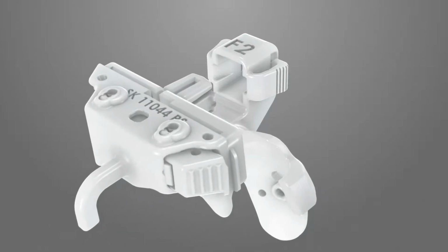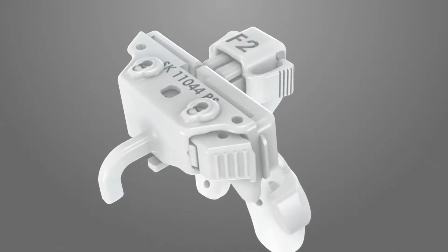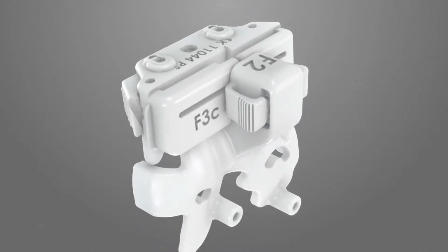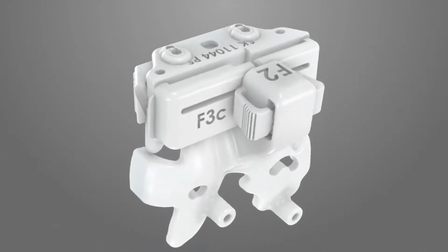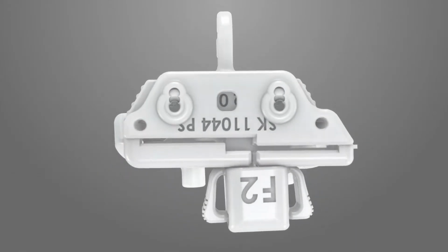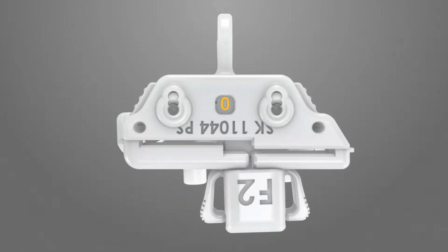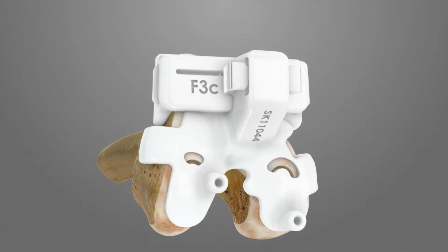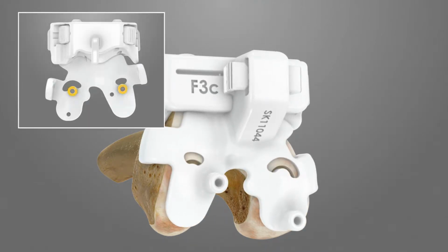Attach the alignment iJig F2 to the captured distal resection iJig F3C. Ensure the distal resection key iJig F3A is properly positioned within the F3C iJig to the zero position. Place the iJig assembly onto the femur. The two round protrusions on the undersurface of F2 should seat into the cartilage voids created by the coring tool.